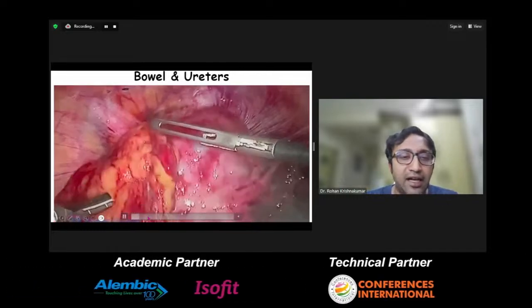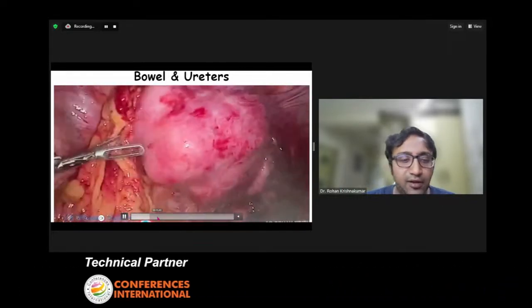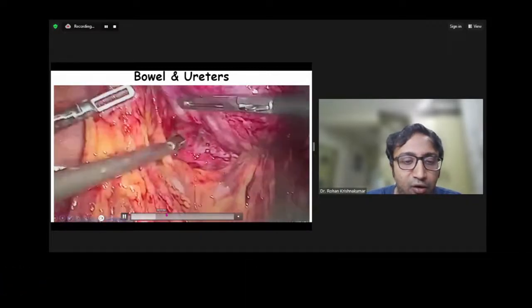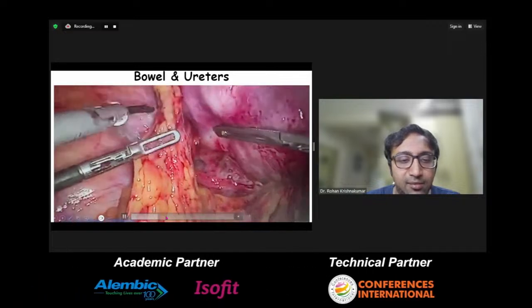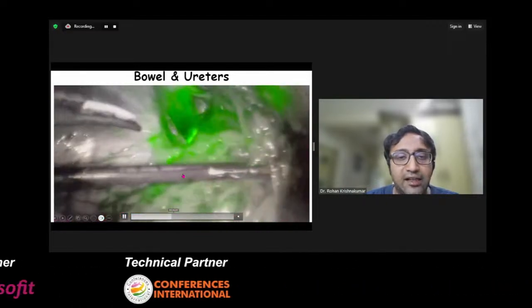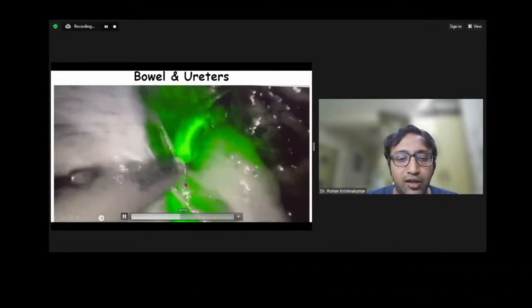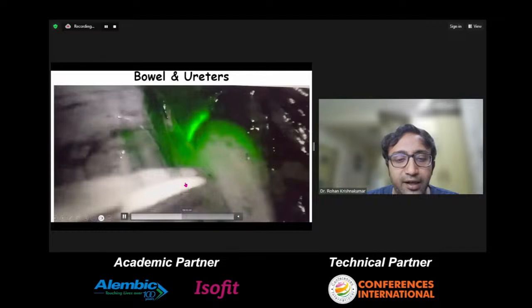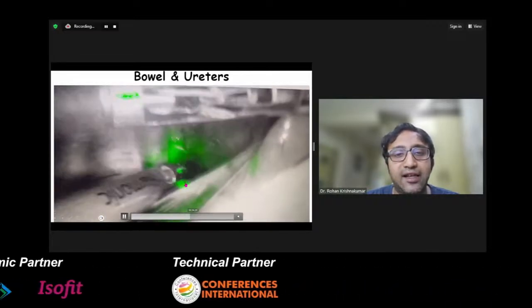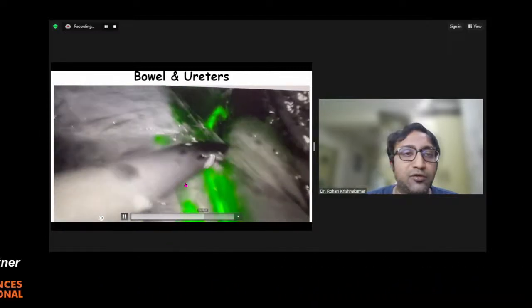So this is a video showing its use in endometriosis. We used it IV, and you can see it's a case of grade 4. Yes, we all know that people who are trained in endometriosis surgery can negotiate through this, but we were trying out the ICG system. Once we injected, you can see the dye has spread and we can easily locate the ureters without much trouble. So even without just predicting where it is, we can see where the ureter is and carefully dissect it, preventing any undue injury or devascularization of the ureter.